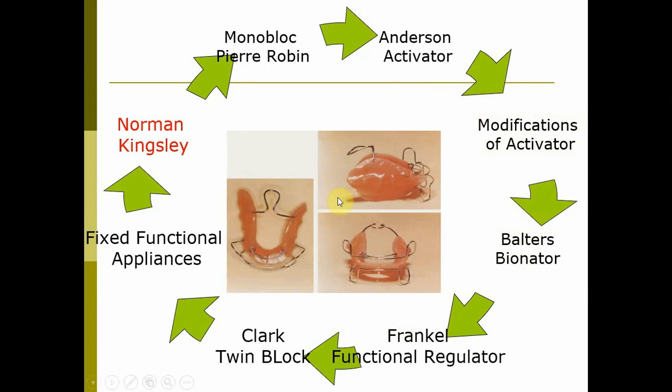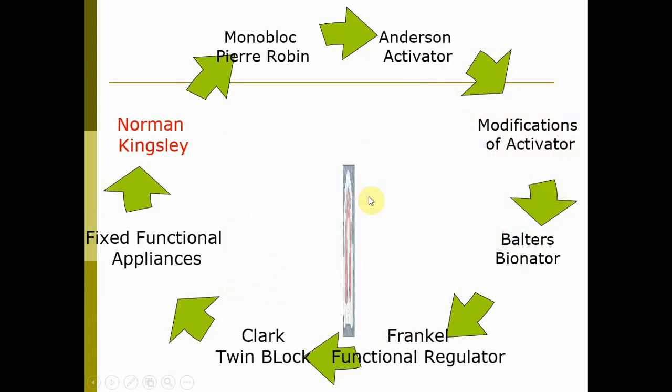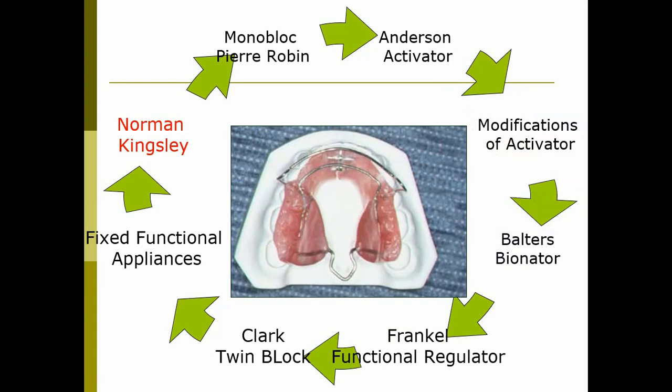So we have increased the wire components over here, but we have decreased the acrylic part over here. So it was to add more comfort to the patient. So this is how it exactly looks.